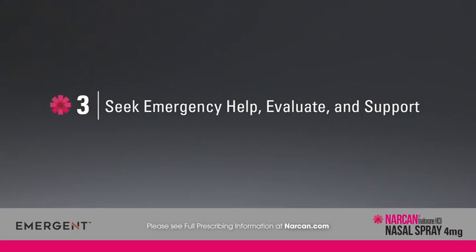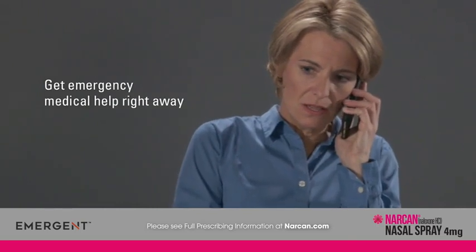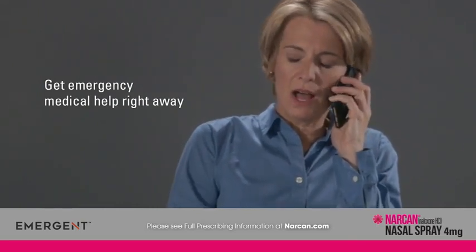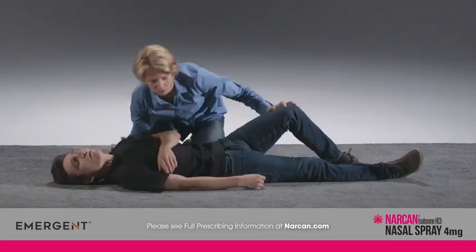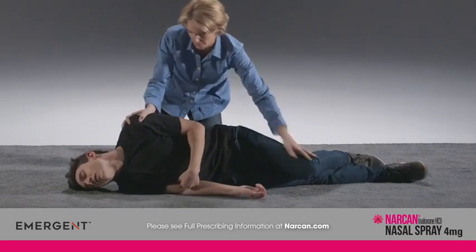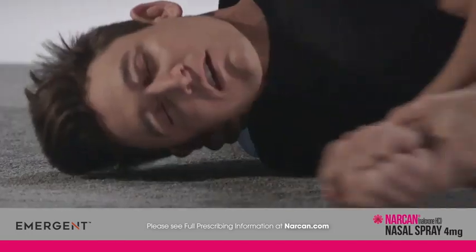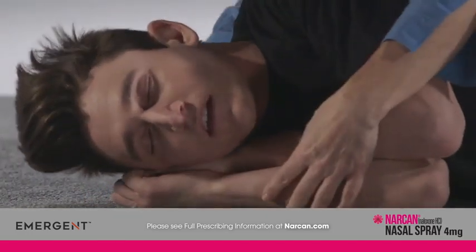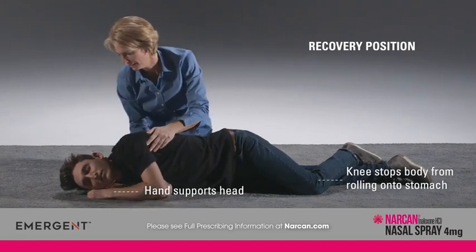After you have given this medication, seek emergency help right away — Narcan nasal spray is not a substitute for emergency medical care. Move the person on their side after giving Narcan nasal spray. If possible, put their hands under their head and bend their upper leg forward. This helps prevent the person from rolling onto their stomach and is known as the recovery position.